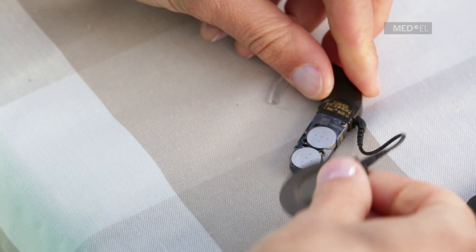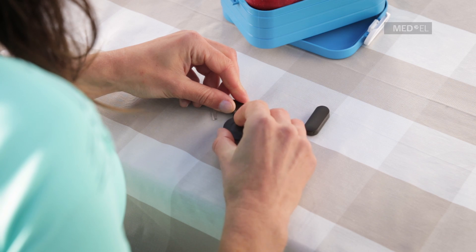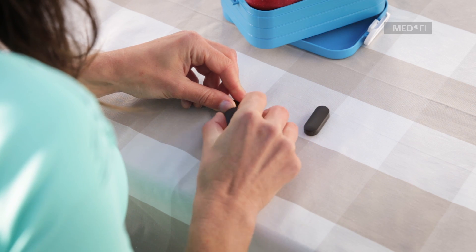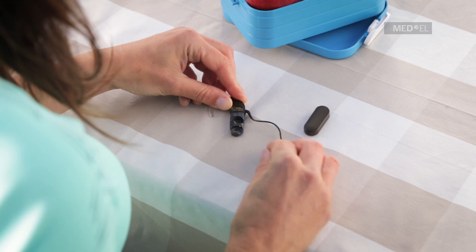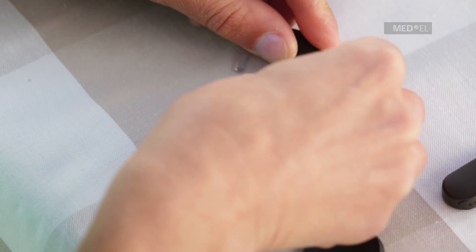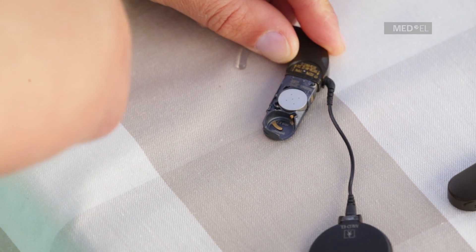Remove the batteries from the battery pack frame by using the magnet of the coil. Insert the batteries into the battery pack frame with the positive poles facing out.